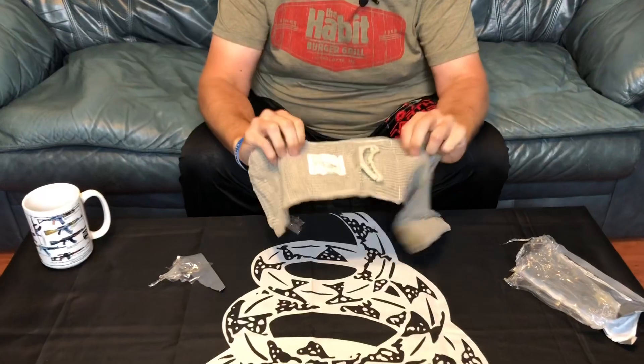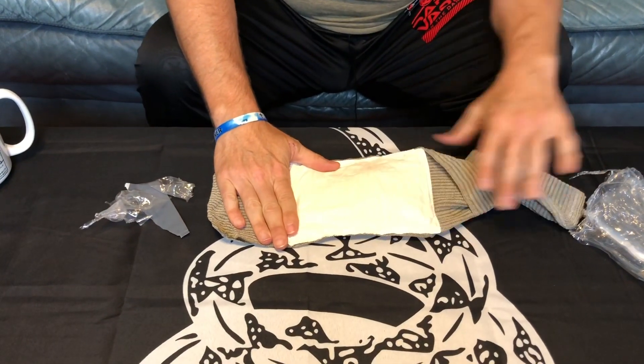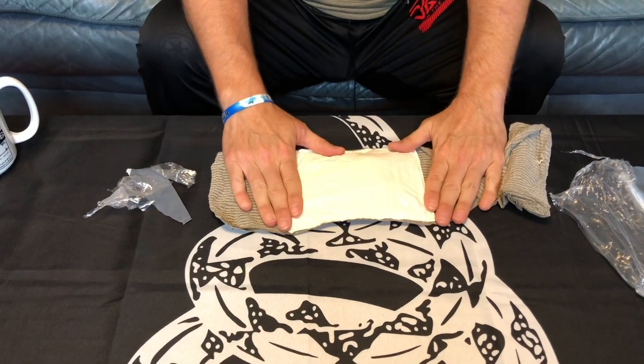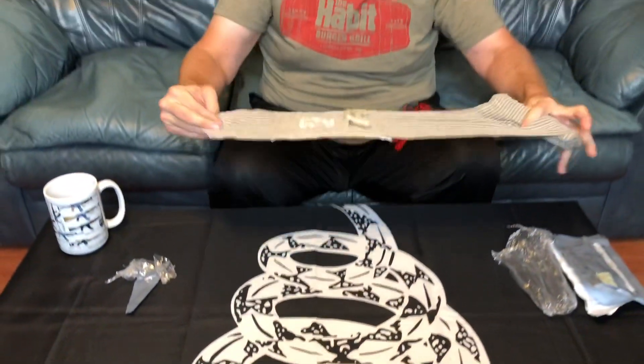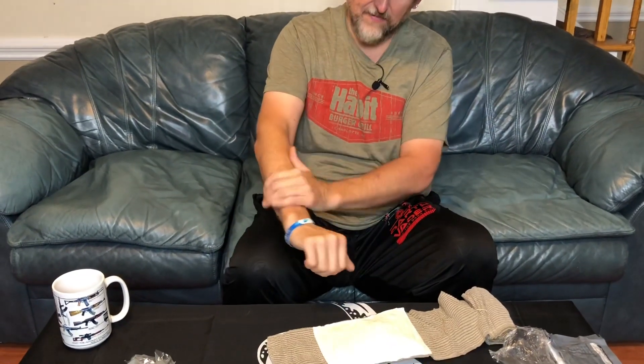Basically what this is, is a wide ace bandage with a gauze pad — not six by nine, but this is the six-inch bandage, so I guess that would be about a four by six pad. Anyway, let me show you how to use it properly.